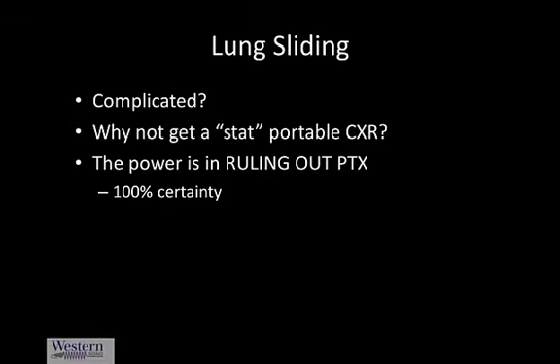So as I've emphasized, the power is in the rule out with lung sliding. I think portable chest x-rays that take 15 minutes to an hour, depending what institution you're in, is an unbearable period of time to wonder if somebody has a pneumothorax.